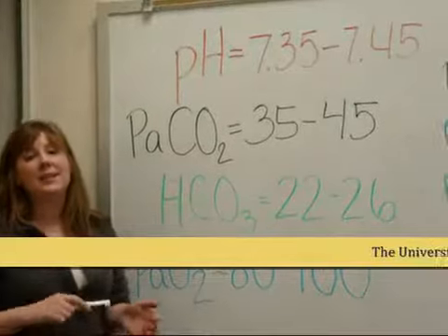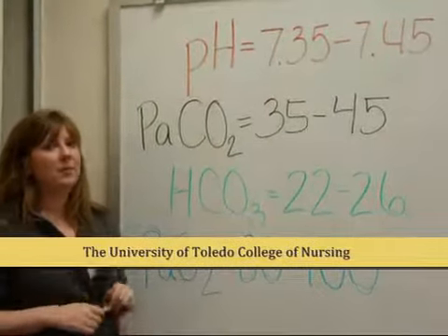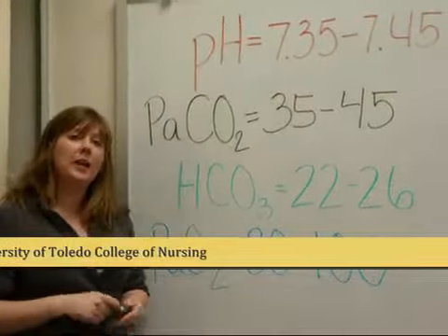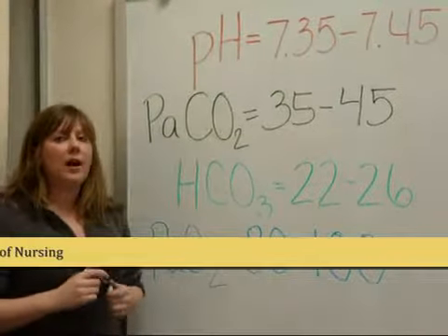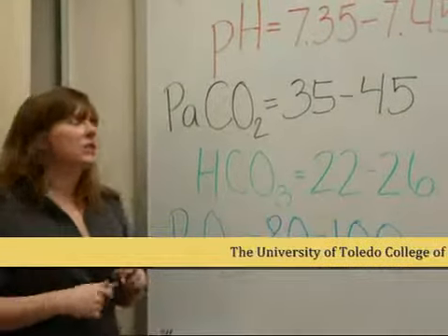Hi, we're BSN senior students from the University of Toledo in the nursing program. We're getting ready to graduate this spring, and we're going to talk to you today about how to read arterial blood gases, otherwise known as ABGs.